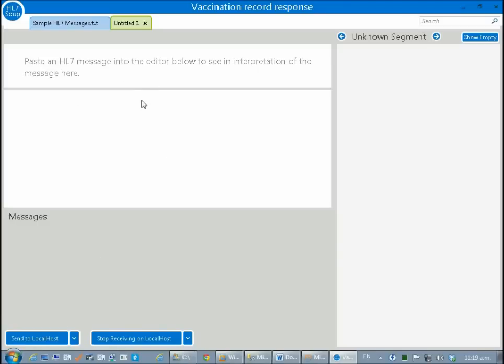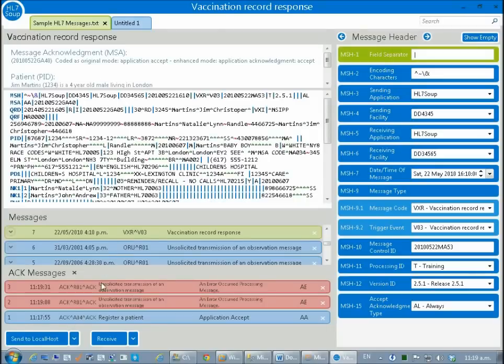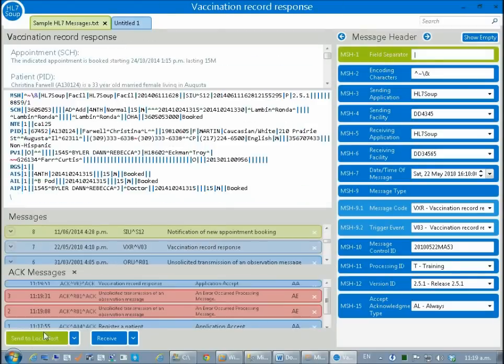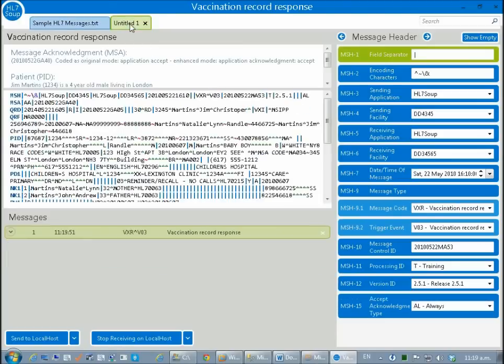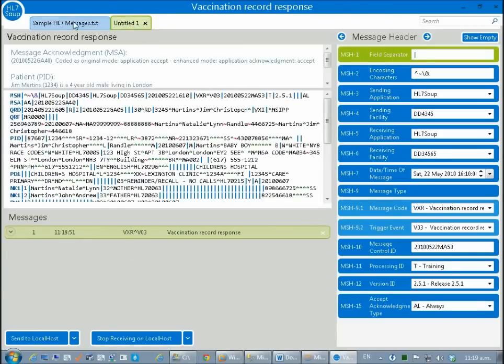Then we're going to come back to our main message and let's try another message. I'm going to hit send to localhost and now we've got a successful ACK and the message has come through.